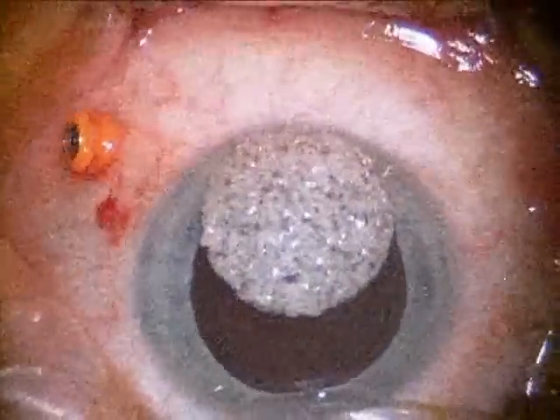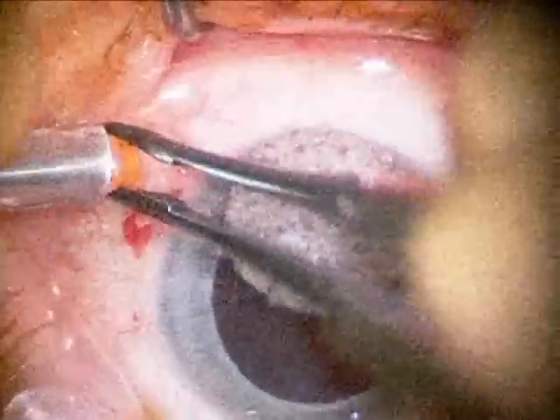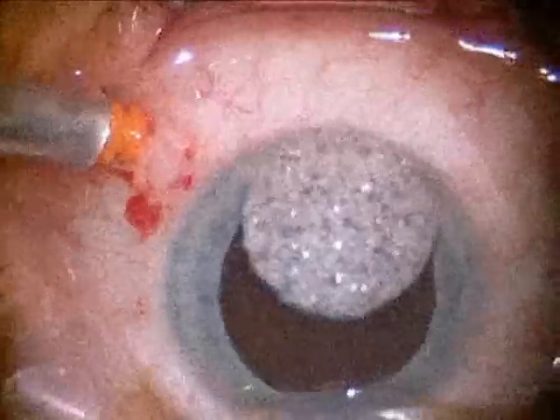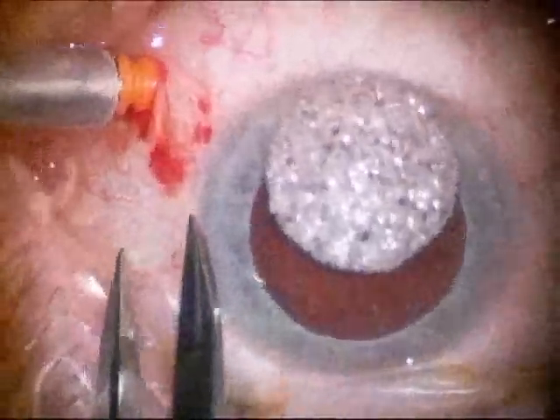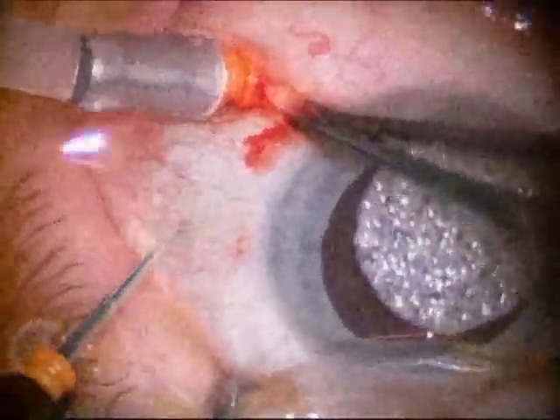Here you're seeing one of the ports being inserted into the eye. That port is used for infusion. Here you see an infusion cannula placed through the port, and this will maintain the pressure at a safe level throughout the surgery. Instruments can safely be introduced into the eye just a few millimeters behind the colored part of the eye.